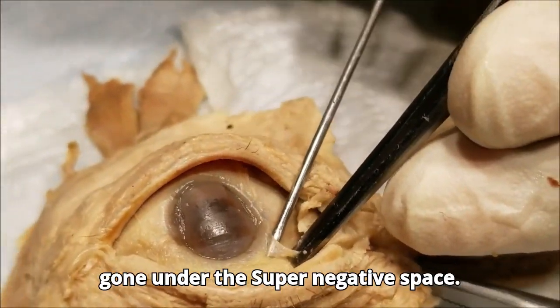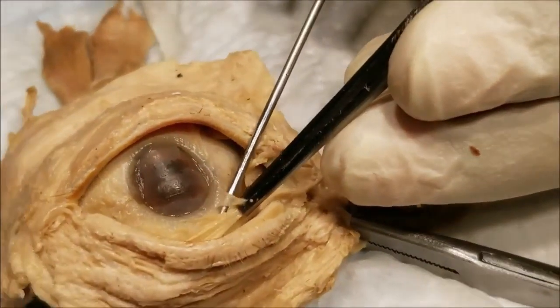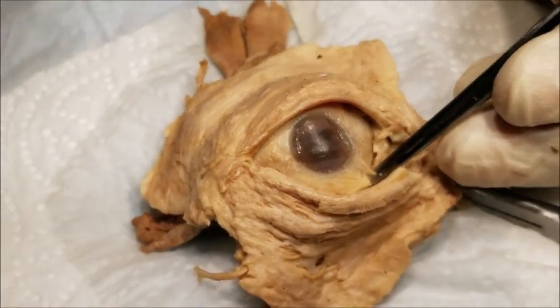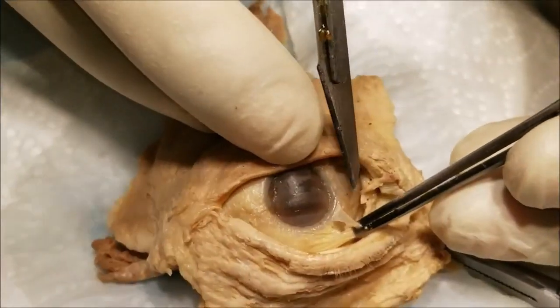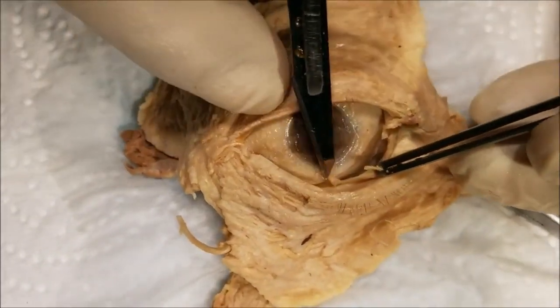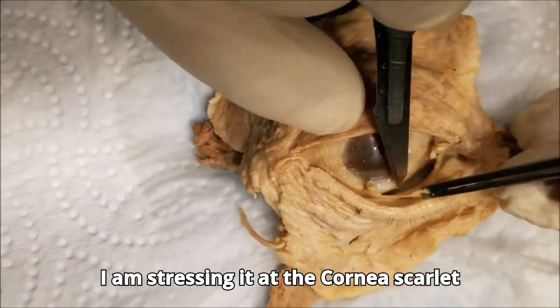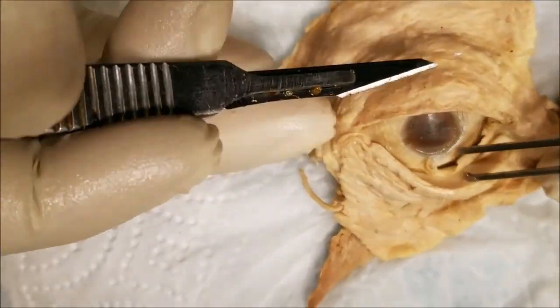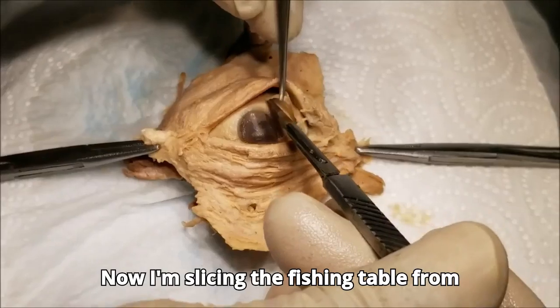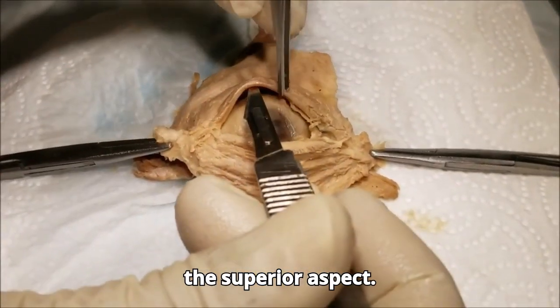And my instrument has gone under the subconjunctival space, and I'm slicing it at the corneoscleral junction. Now I'm slicing the conjunctiva from the superior aspect.